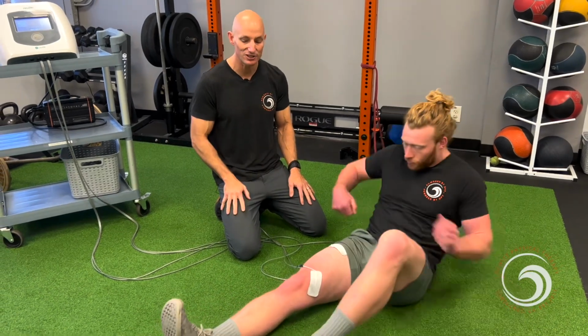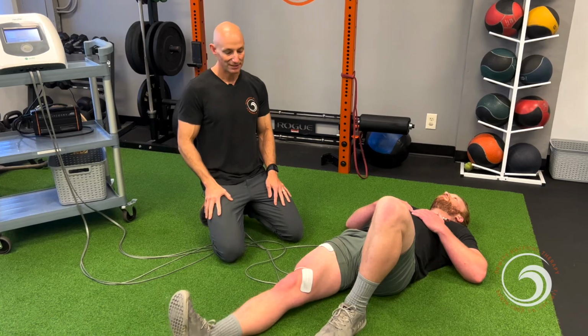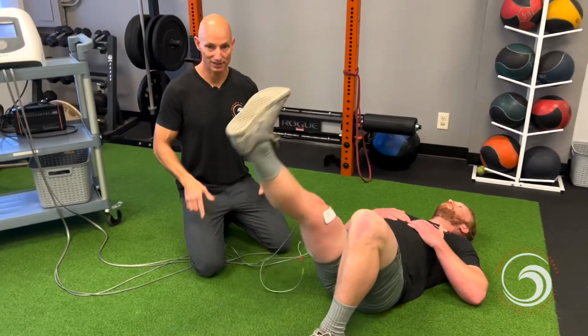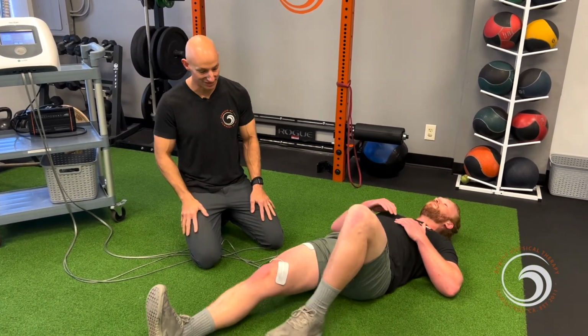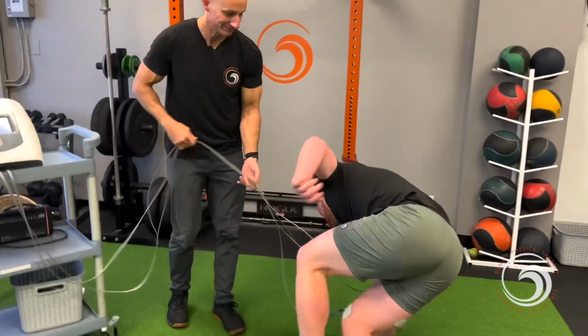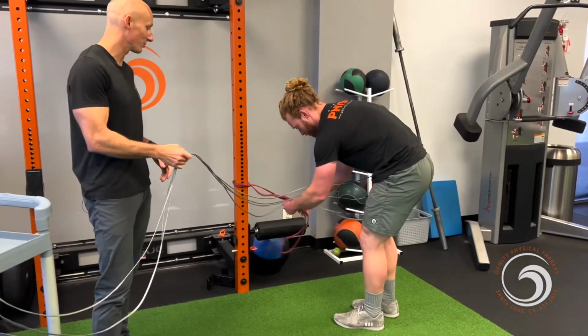We can take it into our quad sets, as our straight leg raises. Even if he doesn't have a quad lag, we're just reinforcing movement patterns with this, and that's okay. We're still going to get more out of it. We want to think about working smarter, not just harder. Still want him to work hard, but not only hard. All right, next, go ahead and put your right leg through that.